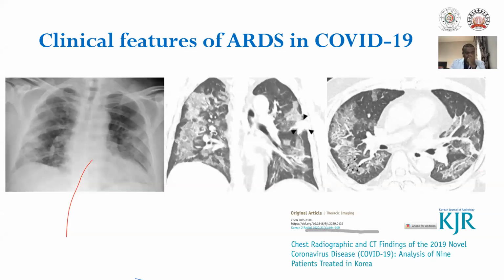The third patient shows a multifocal patchy peripheral consolidation bilaterally, except the upper zone of the left lung. The coronal CT also shows confluent mixed ground glass opacities and consolidative lesions in the peripheral bilateral lungs. And also you can see a discrete patchy consolidation on the left upper zone in this patient. Okay.